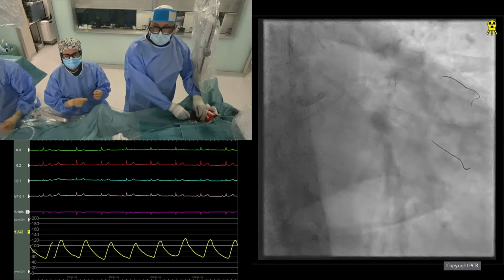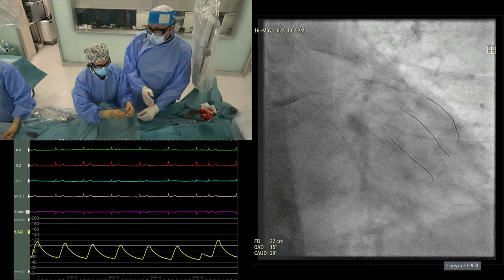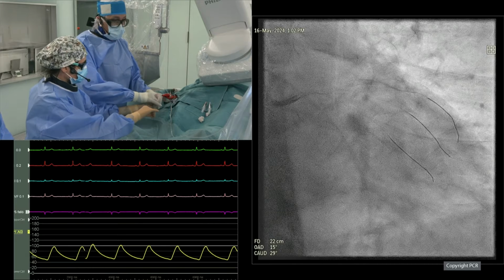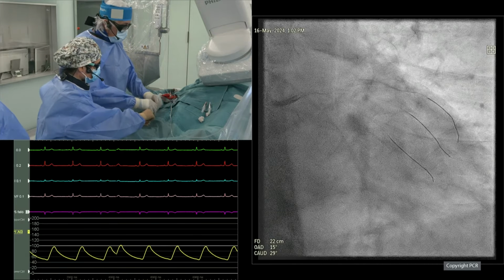Perhaps the most important safety test is to make sure that you do not have a perforation, which is fortunately not frequent, but it's probably the most important. I will say safety tests. Yeah, the disruption of these nodules that are so occlusive. Once they get disrupted, sometimes they get even more into the lumen. We see this with OCT. Sometimes when you modify them, you can see them even more coming into the lumen. So I think it was probably more related with that, but we're going to see. We'll check.